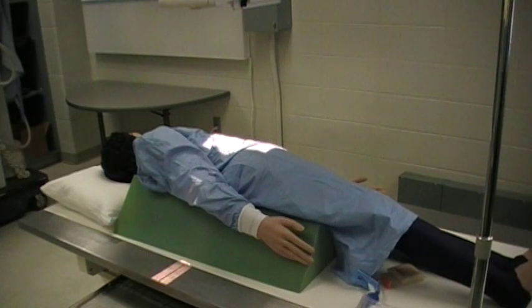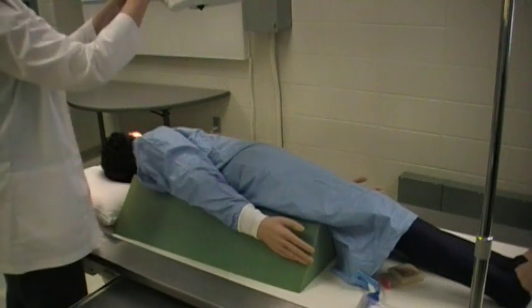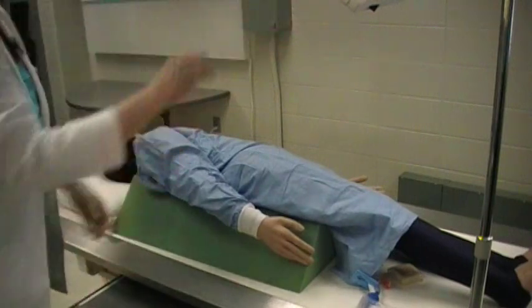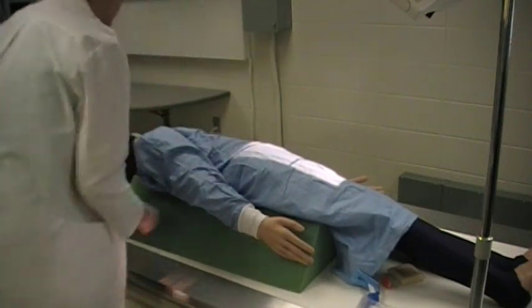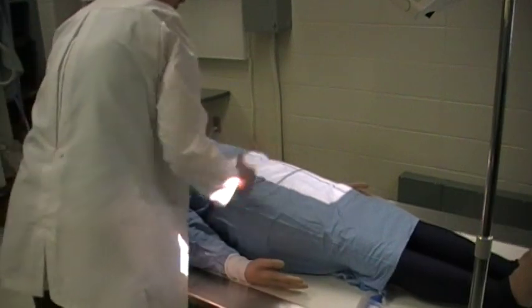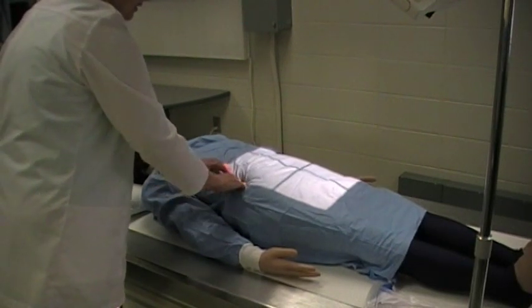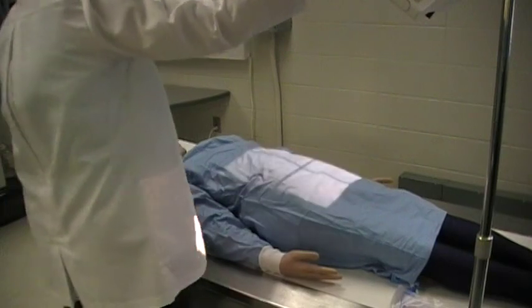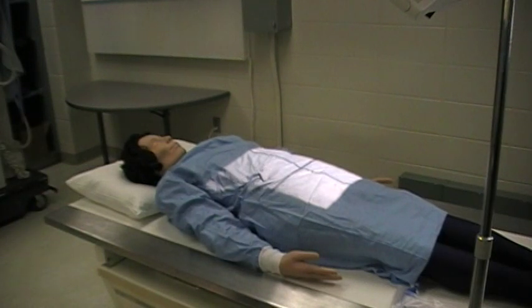I'm going to do the AP axial for the rectosigmoid. If your patient can turn prone, then you do a 30 to 40 degree caudal angle. But I'm going to do the cephalic angle since my patient in the AP will be supine. Our central ray — once I have this mid-sagittal — the transverse line will be at the level of the crest, then the ASIS, and then two inches below that. So I have this transverse line two inches below the ASIS — that is our AP axial for the rectosigmoid.